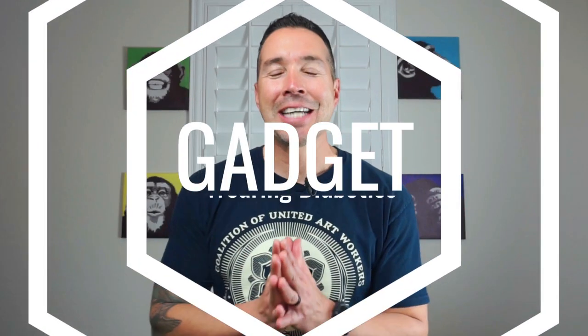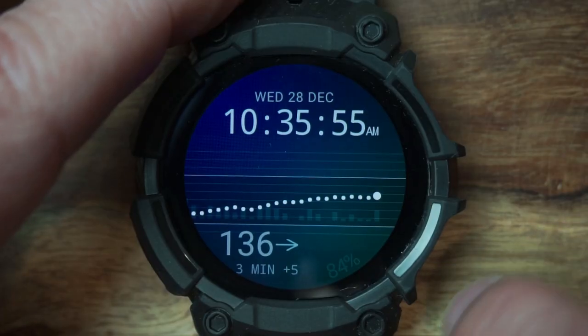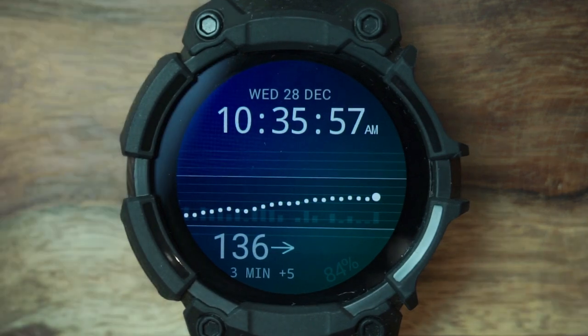Welcome back, all my gadget-wearing Type 1s, Type 2s, MODIs, and LATDAs. Hey, I'm Ben — I'm a paramedic firefighter and a Type 1 diabetic. Are you having trouble finding an easy app or tutorial to help you view your CGM readings from your smartwatch? I've got an easy solution for you. Smartwatch wearers, are you ready? Let's get into this tutorial.